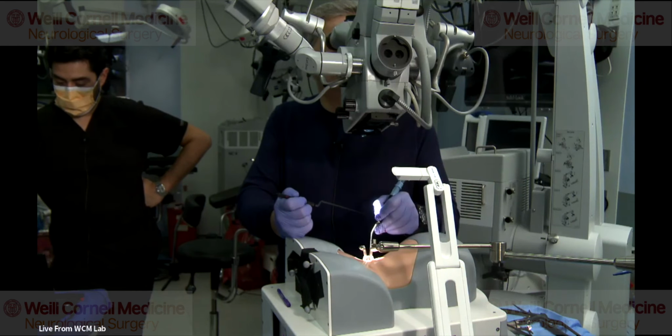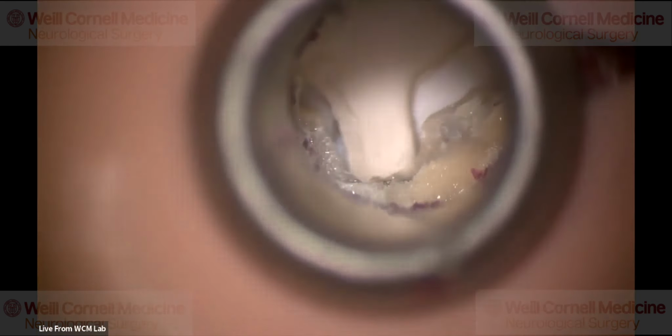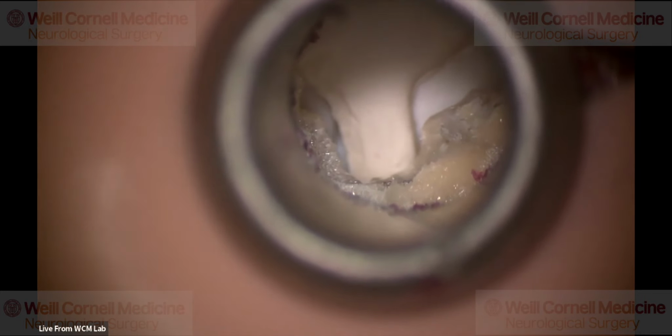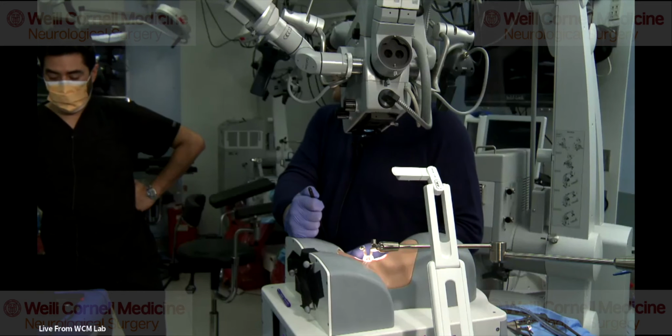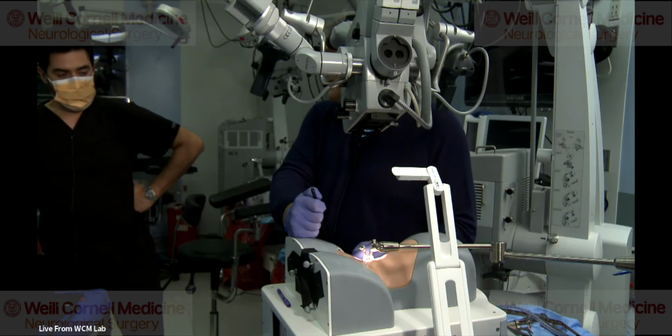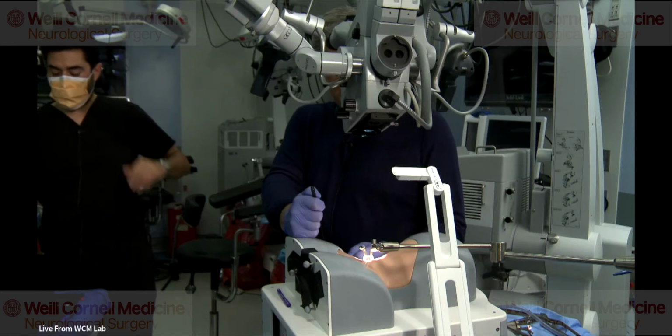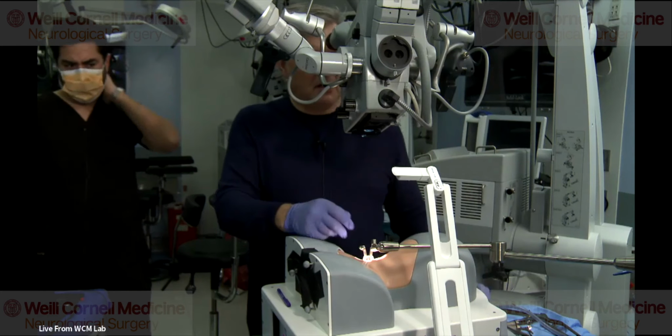So at this point now you've got a nice decompression. You can get another scan to confirm how much facet joint you took. It's certainly interesting in the first few cases you do like that. You want to know how much of the facet did I take. In this case it's nice because we can take the tube out and actually look at the model.